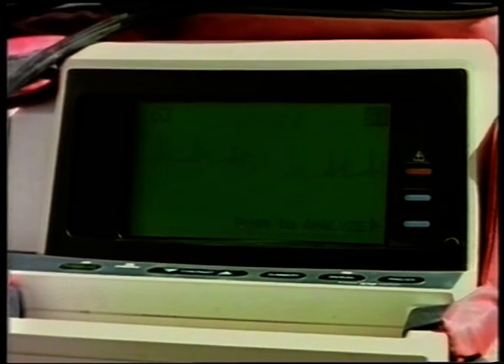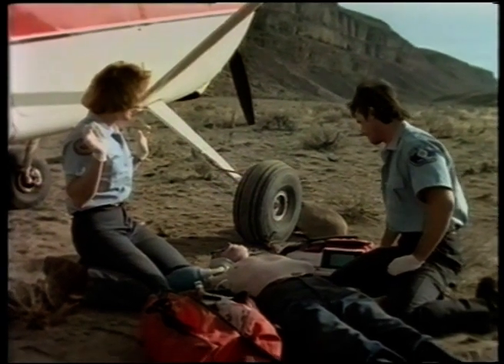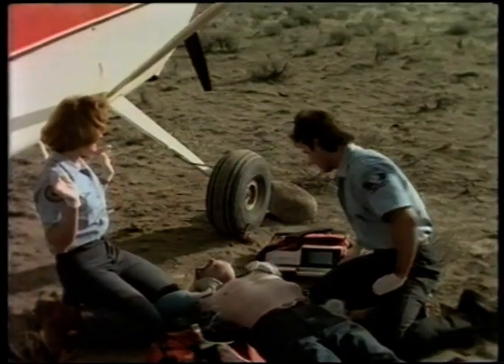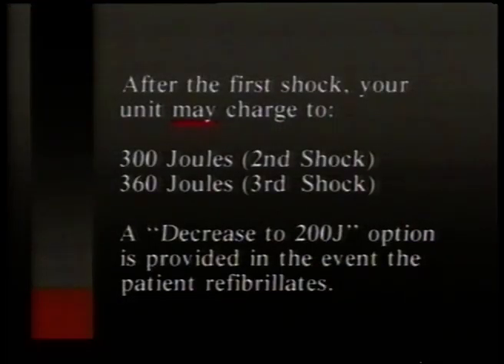Push the analyze button again and remain clear of the patient. Shock up to a total of 3 times or per authorized medical protocols. Depending on your unit's configuration, it may automatically charge to 300 joules on the second shock and 360 joules on the third. The decrease to 200J option that appears during charging to either 300 or 360 joules is provided to adhere to the AHA guideline of using 200 joules in the event the patient refibrillates. You may never use this option. Please refer to your local protocol for guidance.